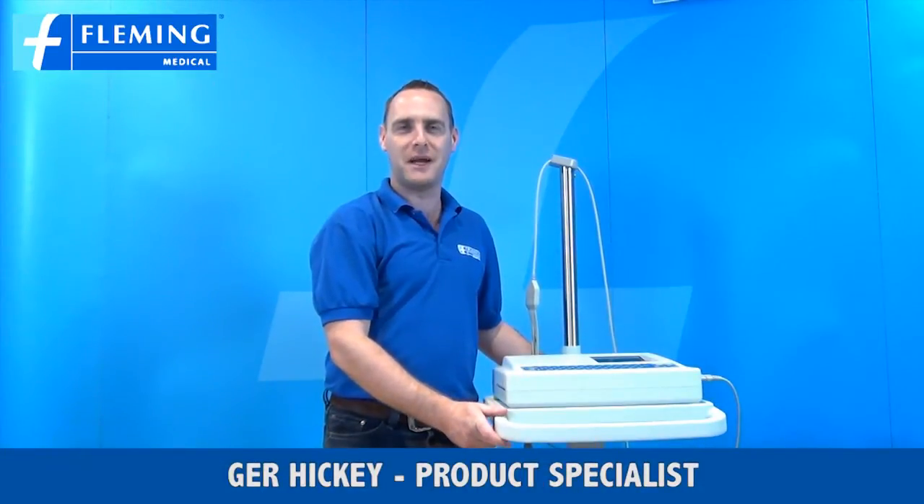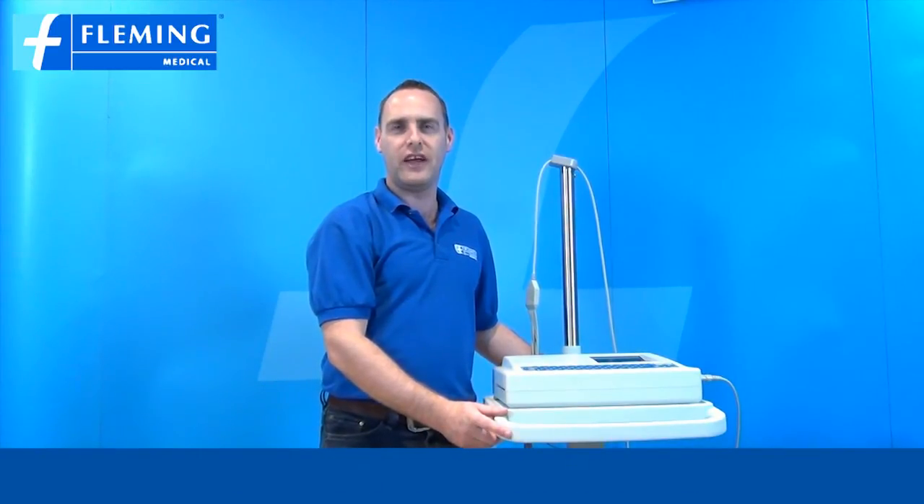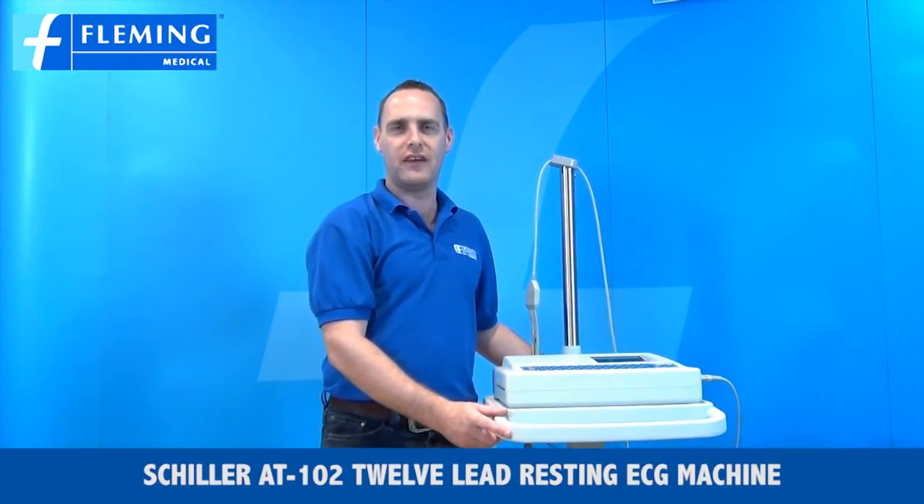Hi, my name is Ger Hickey and I'm a product specialist at Fleming Medical. Today I'm here to present the Shiller AT102 12-lead resting ECG machine.